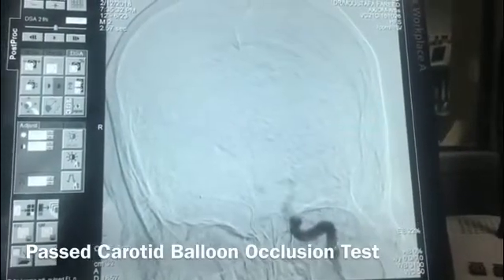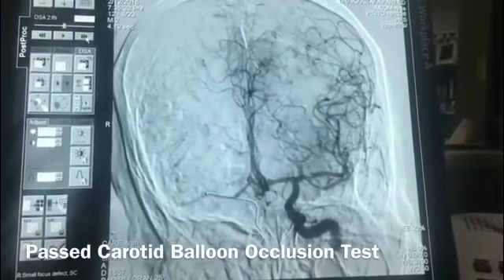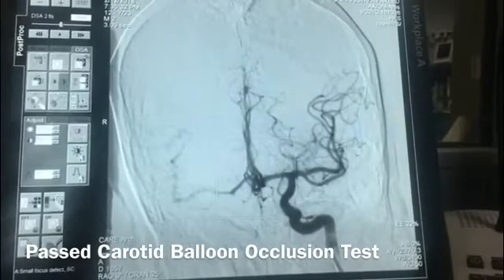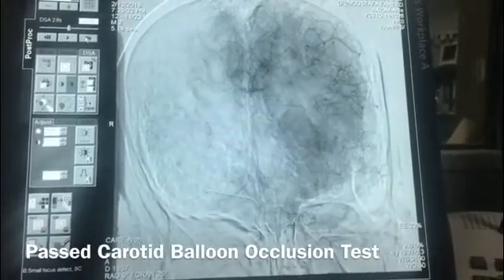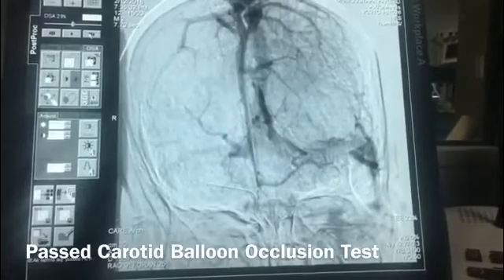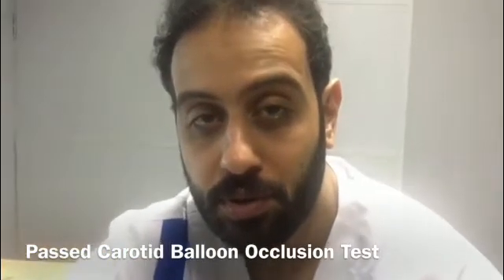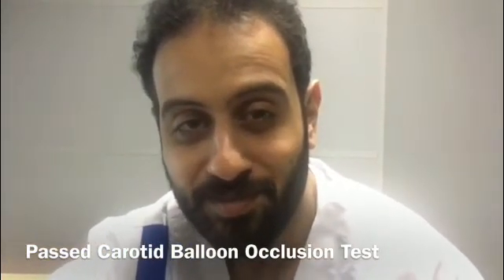After injecting the contrast, the arteries reach the right side — this is the amazing effect of the circle of Willis. This patient passed the balloon occlusion test and is ready to proceed with her surgery safely.